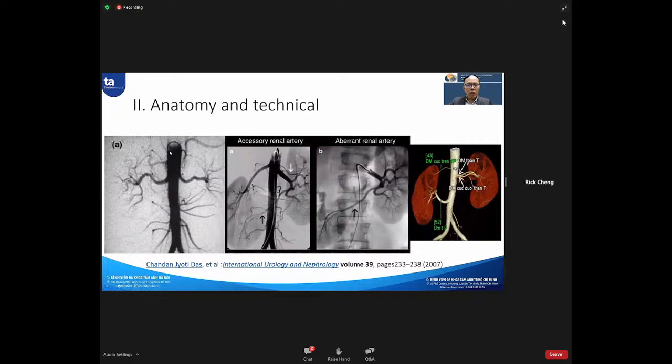So the first step is that you put the pigtail catheter at the level of D12 and L1. You make the aorta angiogram. You see the origin of the branches from the aorta, with the right renal kidney and the left renal kidney. For example, in this case, you do the total global bilan.